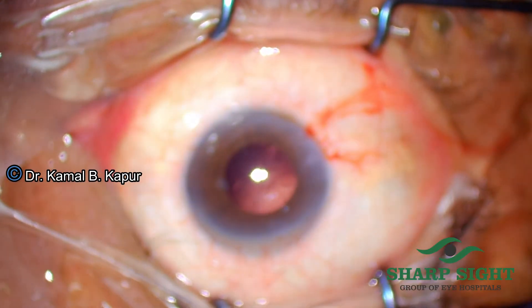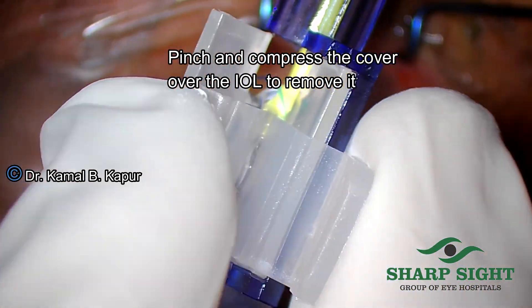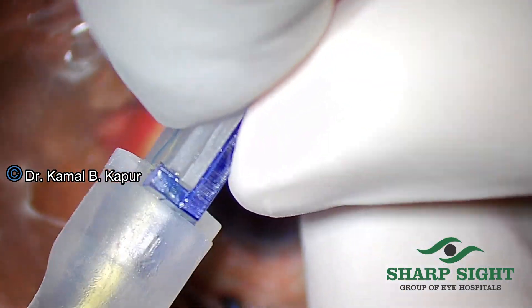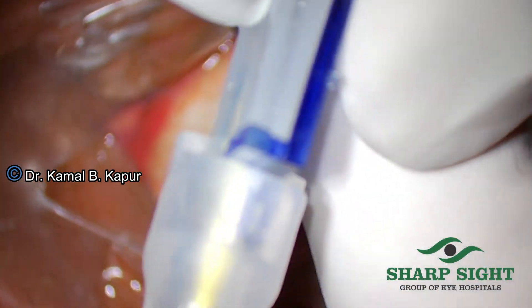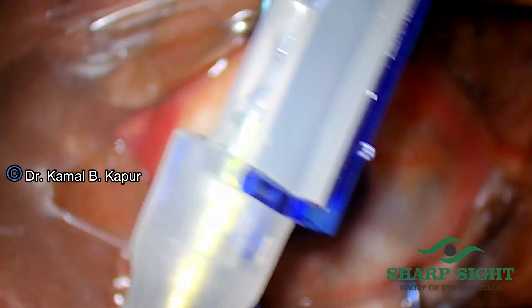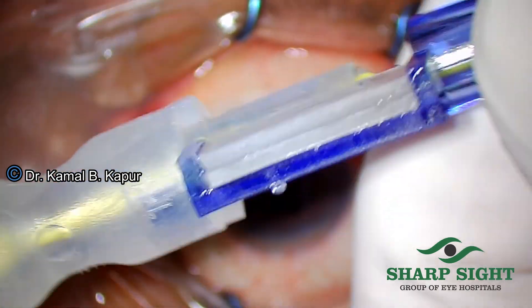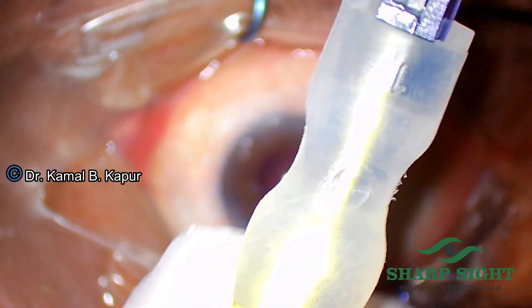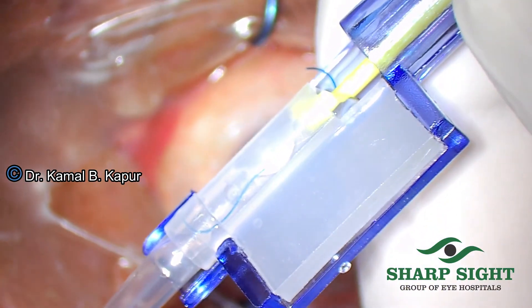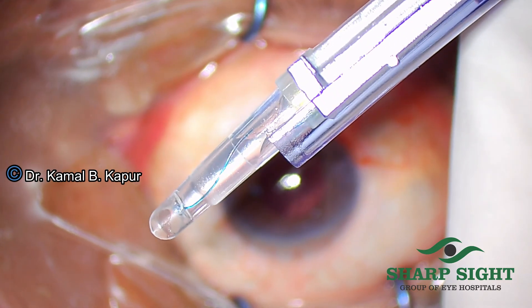For repetition, I will demonstrate loading of another IOL with the same steps repeated: pinching to remove the lock over the wings of the cartridge, then locking the cartridge wings. In this case you will see it does not close so easily, so sometimes more pressure is needed to close it. We make sure that the trailing loop is still outside the cartridge, then pull the cap on the cartridge tunnel. Once done, we slowly push the plunger and see the loop coming straight out of the cartridge tunnel.